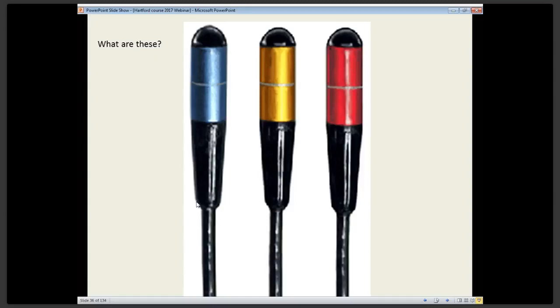Here's an example of diodes. Some of you may have seen these as in vivo diodes. They place it on the patient's skin sometimes to measure dose to a pacemaker. And some therapists may have used the diodes in this form to do daily constancy monitoring, daily dose monitoring of the linear accelerator as part of their morning warm-up procedure.